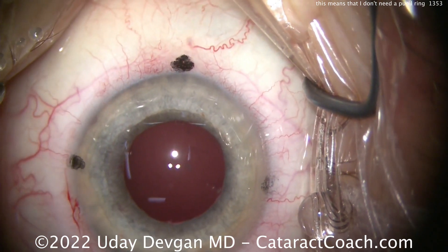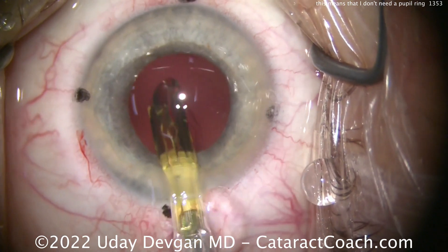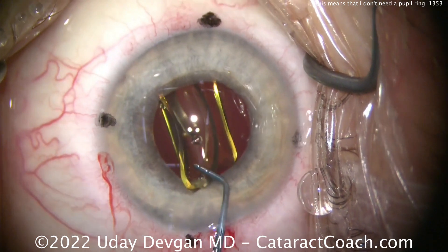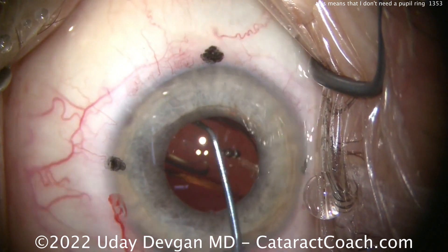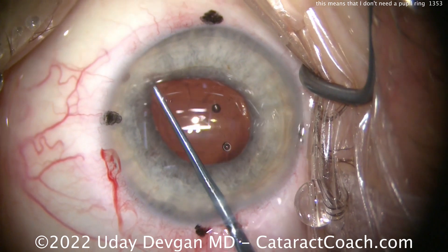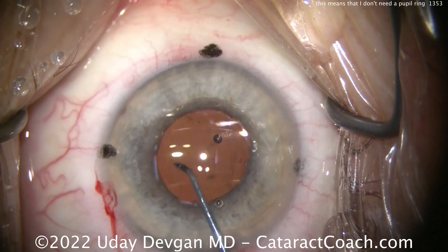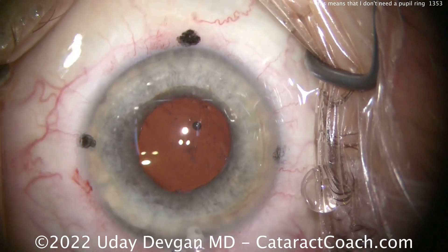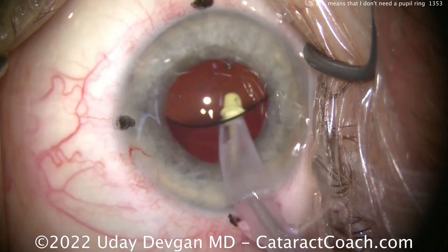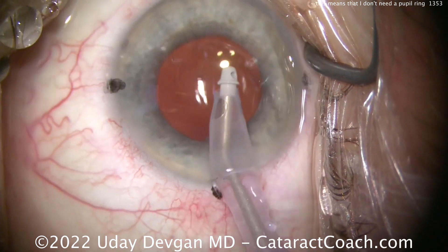Inflating our capsular bag here with viscoelastic. We'll get that toric monofocal lens implanted in the capsular bag — there it goes, nicely done. My technician and I have done like 10,000 cases together, so I always know the lens will be loaded perfectly. Getting the lens into approximate position and getting those haptics to open up, ensuring they're not lifting the iris, making sure that IOL is completely in the capsular bag, and looking around to make sure there's no residual cortex. Time to remove the viscoelastic — we're going to go underneath the IOL, because with a toric lens I want that posterior aspect of the optic to sit directly on the posterior capsule, which will help prevent it from spinning, becoming mis-rotated, or mal-rotated.